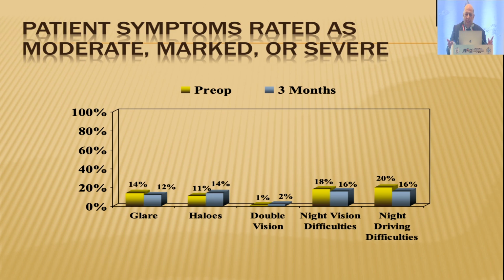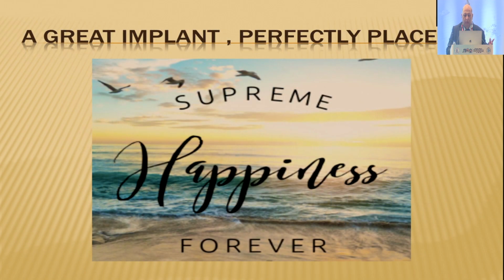So it is said, for example, I've got a panoptics lens in my eye. In my case, my reading distance is set at 12 inches. If I wanted a closer one, I would have put in a Zeiss, and I would have got 8-9 inches in distance. In some of them, it is much further off. But they need to know exactly what they're going to get.